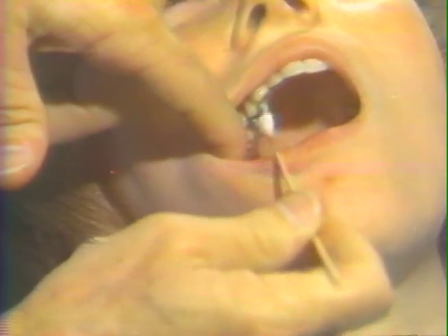Now close your mouth. This time, Betty, turn a little bit to the right towards me. Open your mouth real wide. Let me pull your cheek and hold your head in that position. The cotton tip applicator for the right greater palatine nerve is now placed in the area of the greater palatine foramen and held in place with retraction. The mouth remains open. Burnishing of the tissue and removal.